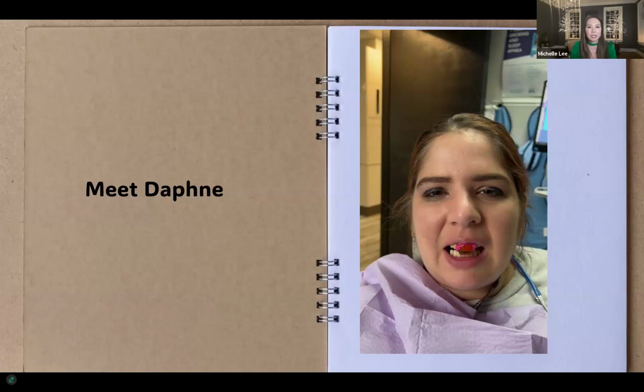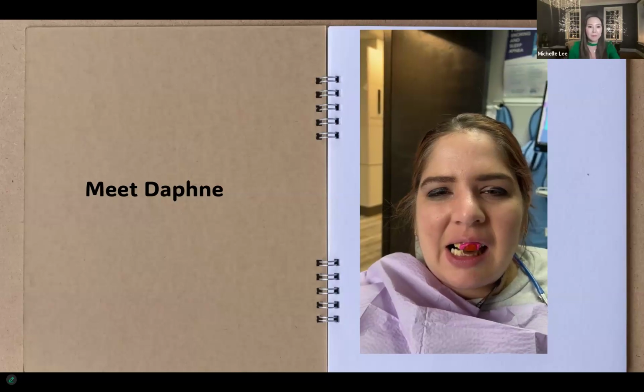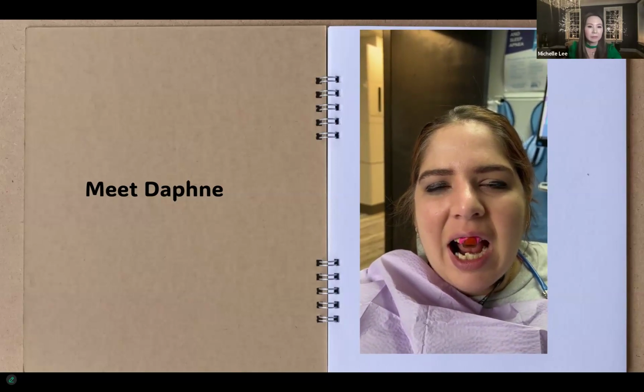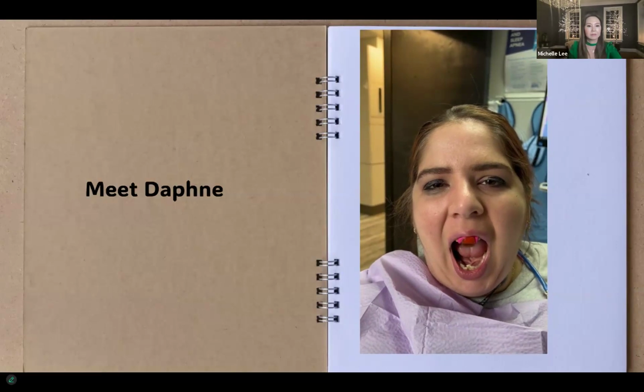So here is a patient. I'll paint this story for you. She came into my office with jaw pain, popping and clicking, and she has an anterior deprogrammer in. Again, this is the anterior-only deprogrammer. This does not go home with the patient. This is a diagnostic tool. Side to side, left and right. Okay, now open, close, open, close.